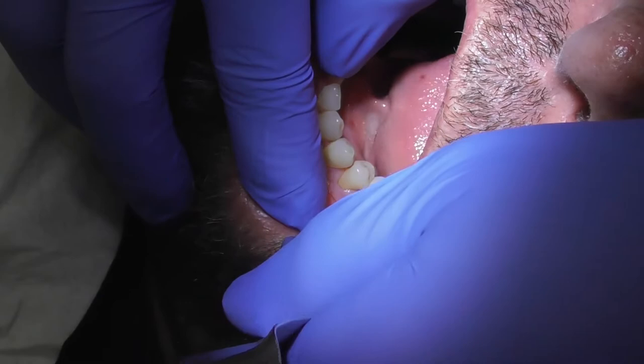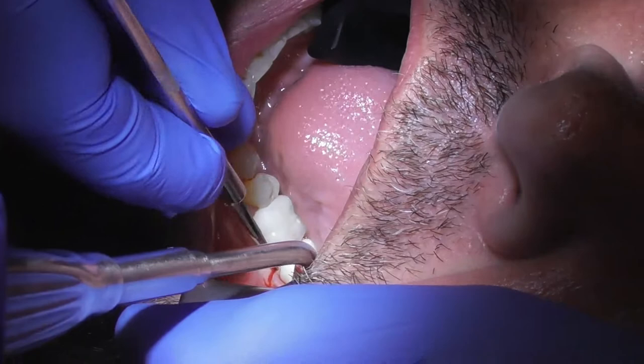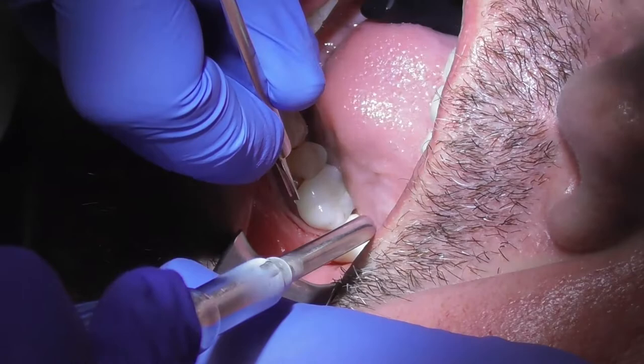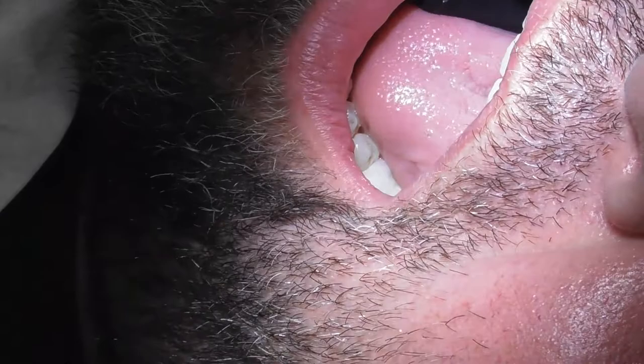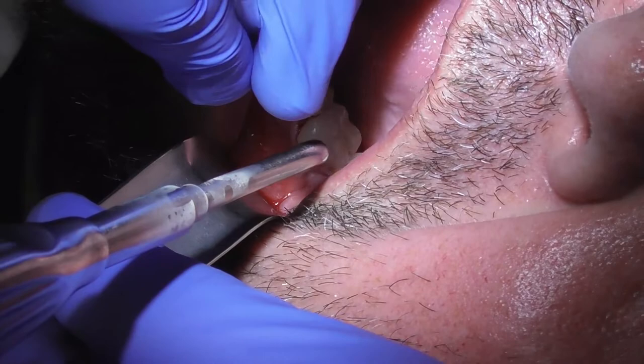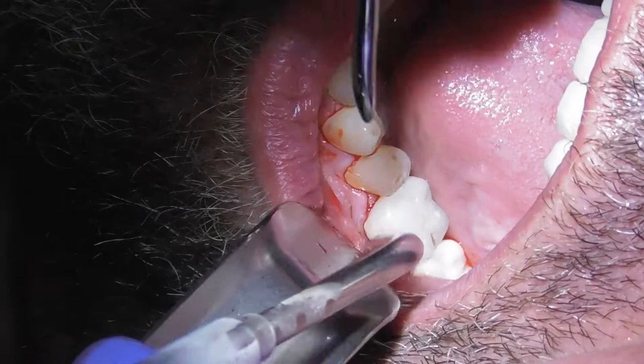Now what I'm going to do is just gently pull this back, then I need to get the gum tissue back a little bit so I can see. It's mostly along the necks of the teeth that we can elevate and move things back, and then stitch things back up again. You should be good here — nothing sore, is it just the thought of it? Okay, nice deep breath — you're doing great.